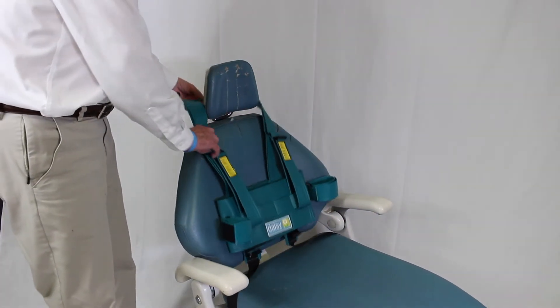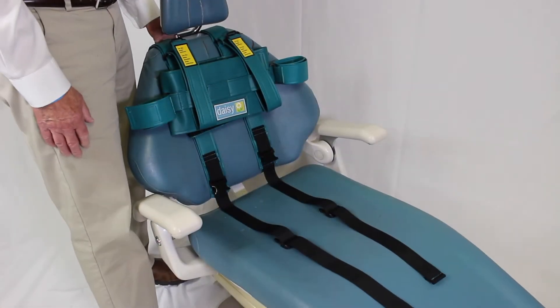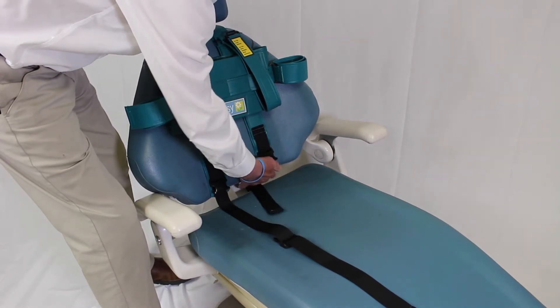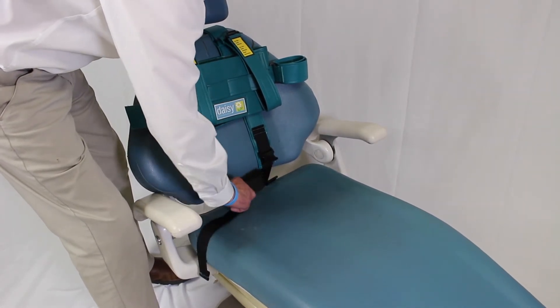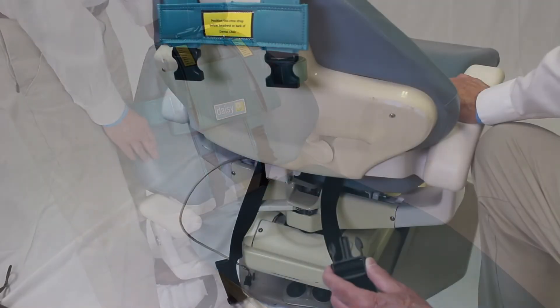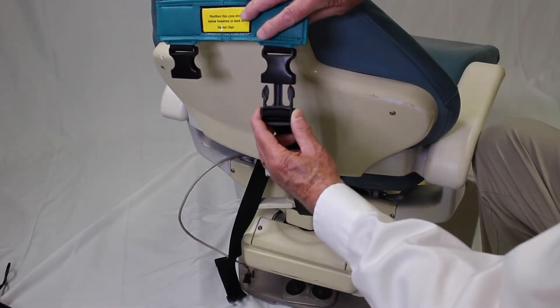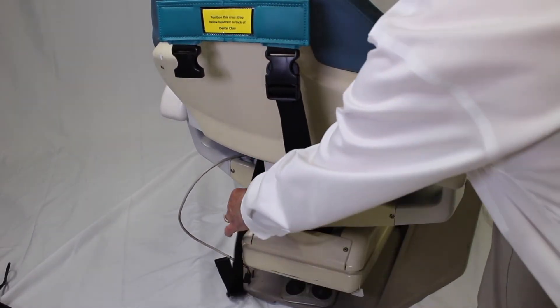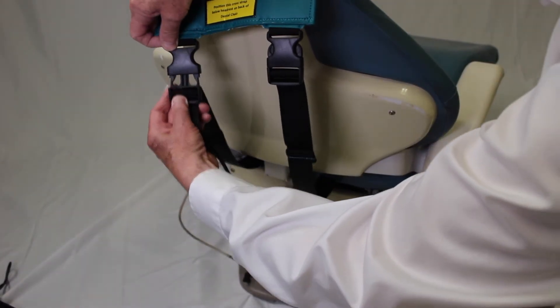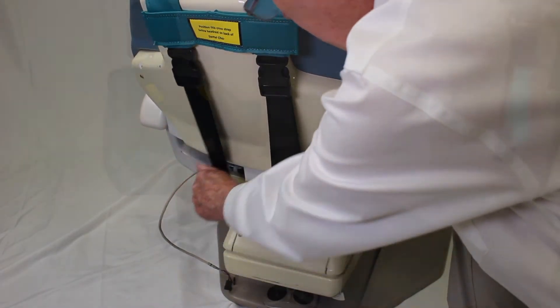Position the DAISY harness on the top cushion, then fold it around the top headrest. Insert the two buckle straps between the top and bottom cushions. Be sure the cross strap with the label is positioned below the headrest. Then attach the two buckles on the back of the dental chair. Once these buckles are attached, pull the strap ends of two straps to tighten the harness to the seat. The straps must be tight on the seat.